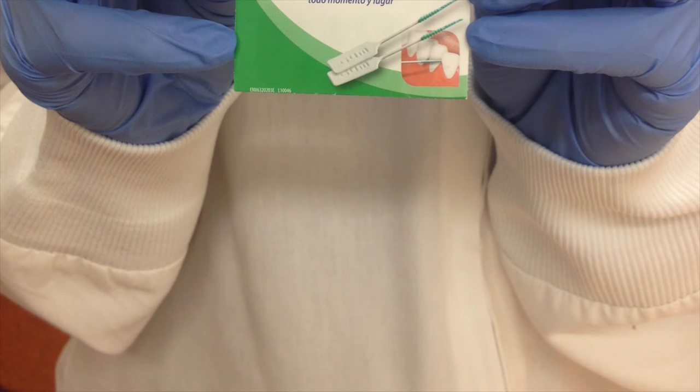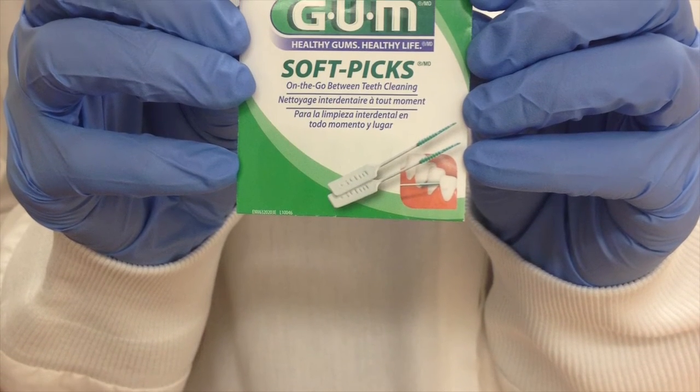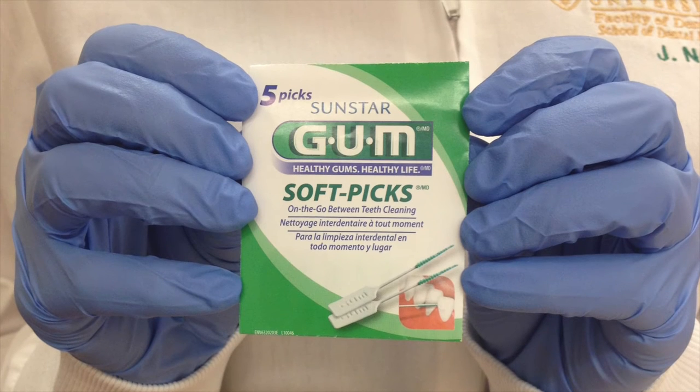Soft picks. A smaller version of a proxy brush. Much like the proxy brush, this is used interdentally. The bristles are much shorter and this may be a better option for patients who do not have quite as large spaces in between the teeth.